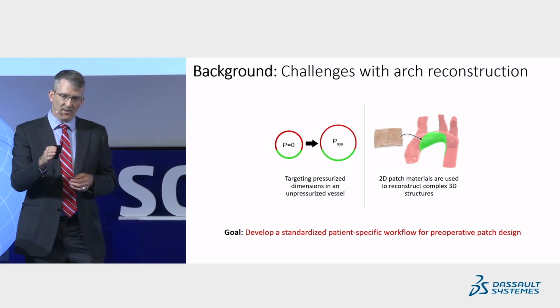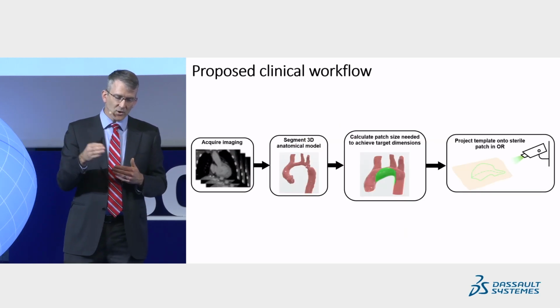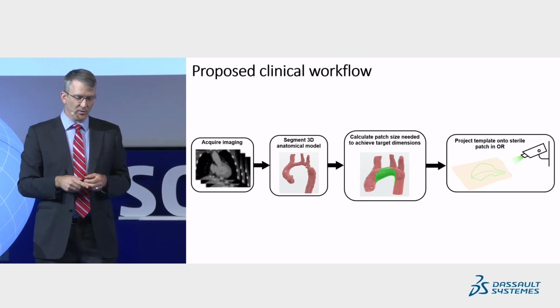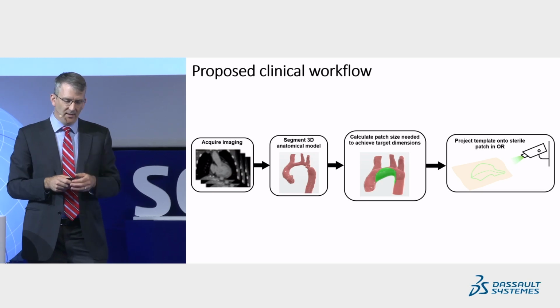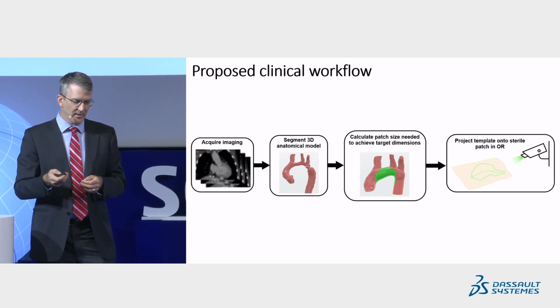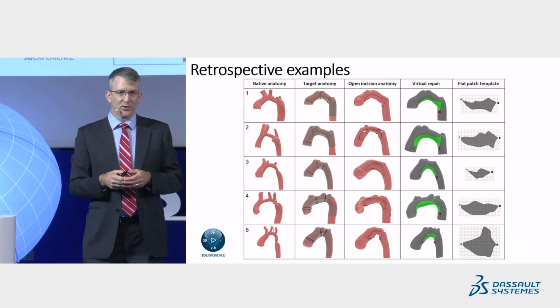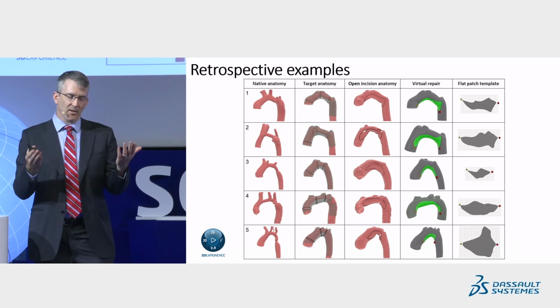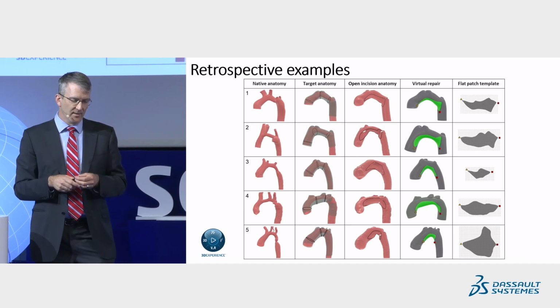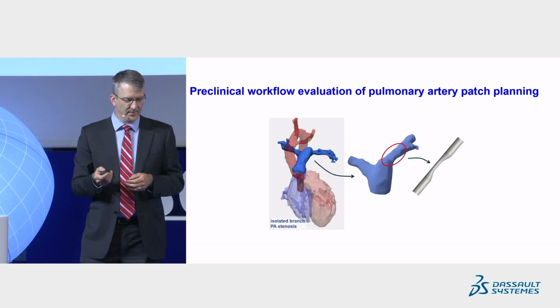So what we really need is a standardized patient-specific workflow for these patch designs. So we've been developing that, similar to the other workflows that you've seen, to achieve a patch size that's going to work, and then obviously take that into the OR and project it with the laser. And so we've done this retrospectively, and Ashley and Jang from Dassault, I think, are in the room, have played a really important role in helping us develop this technology, and we're on the verge of doing our in vitro validation and start to use this clinically. This is all done on the 3D Experience platform.